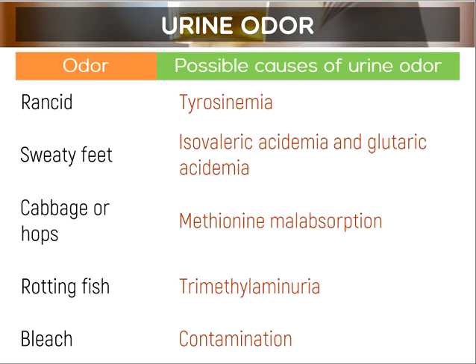And then another side note, kindly take note: if swimming pool odor, it can be Hawkinsinuria.